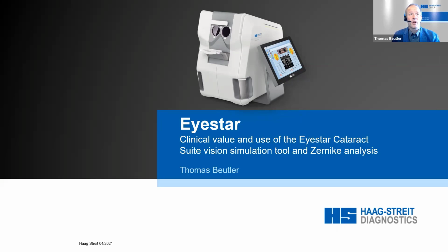So tonight we're going to talk about the cataract suite of Eyestar and specifically the vision simulation and Zernike analysis tool of the unit. As said before, please use the Zoom Q&A functionality to ask questions, or also the chat window. We're going to answer questions at the end of the session. And let's just start and have a first look.